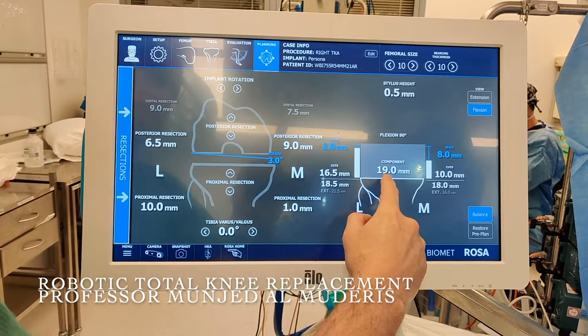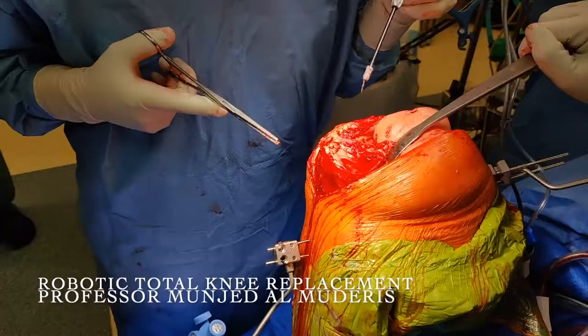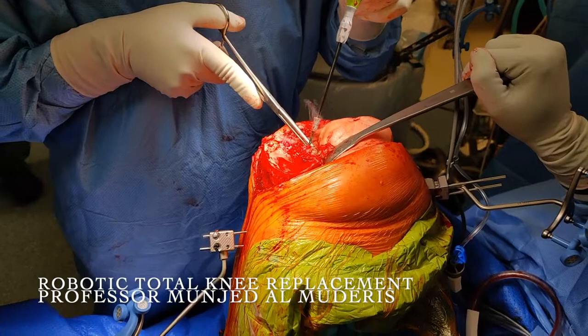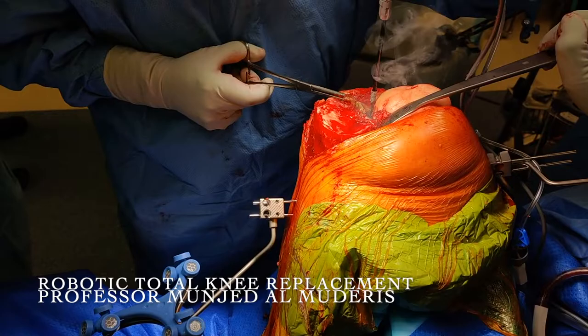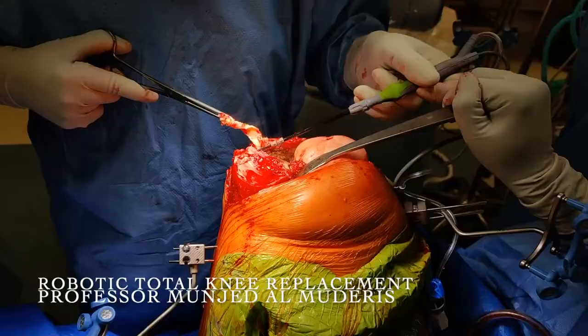Based on this information, I need to go back and release more soft tissue to achieve better balance in extension. One of the tricks to balance the knee is to completely release the PCL and completely remove the lateral meniscus. In extension, the lateral meniscus adds substance to the lateral compartment, which pushes the patient further into varus, especially after total removal of the medial meniscus. Care must be taken to cauterize the anterior branch of the lateral geniculate vessel to prevent bleeding.